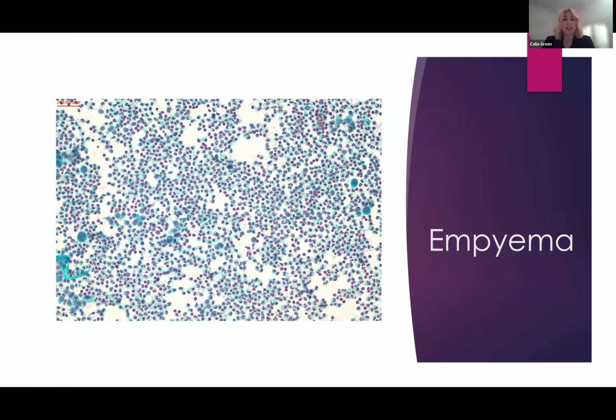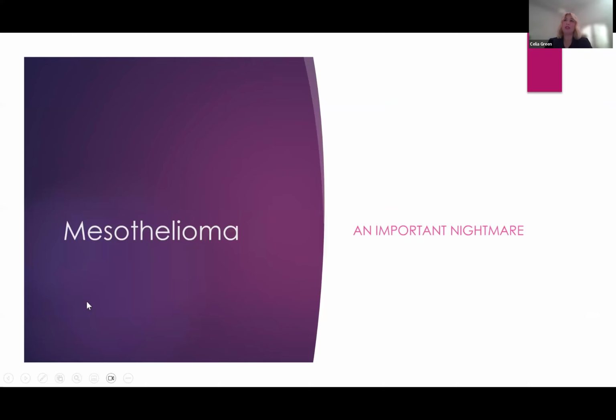And then finally, neutrophilic or empyema, again, because we don't see so many biopsies of this, because usually radiologically it's pretty common, you just get masses of neutrophils with occasional reactive mesothelial cells. So they're the main patterns that we see, and where you're going to normally give you a category, and then that's why it's so important that you give us information, because if you tell us the person is presented clinically like this with a certain infection history or a smoker, then we narrow down your differential diagnosis. And I'll talk a little bit more about what you can do once you get your differential diagnosis.